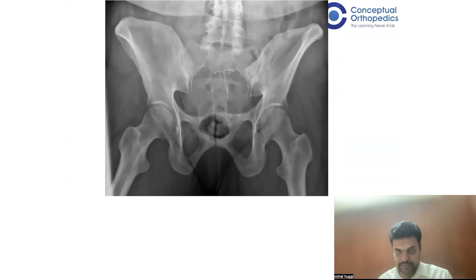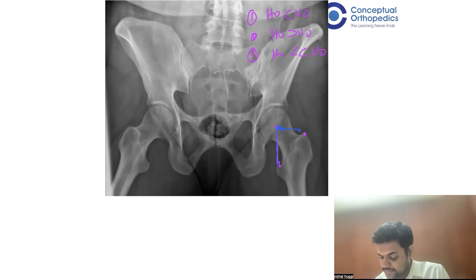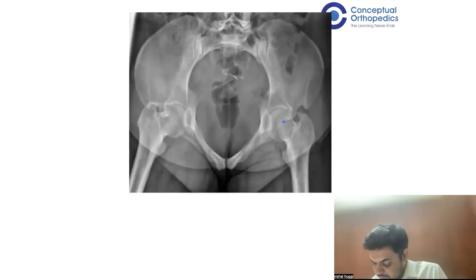Looking at this example, how is the offset here? Which scenario is it — one, two, or three? The hip center is here; the vertical offset appears very large compared to the horizontal. This is the third case — correct. Now in this next scenario, with the hip center here, which scenario does this belong to? Again, one, two, or three?